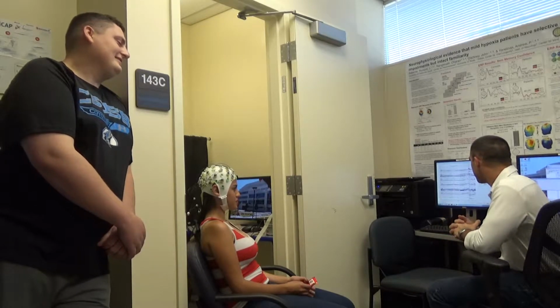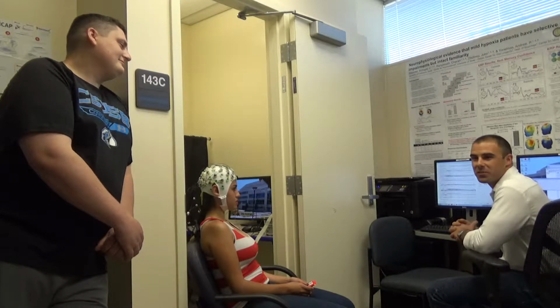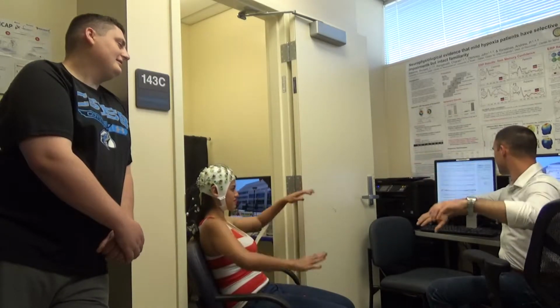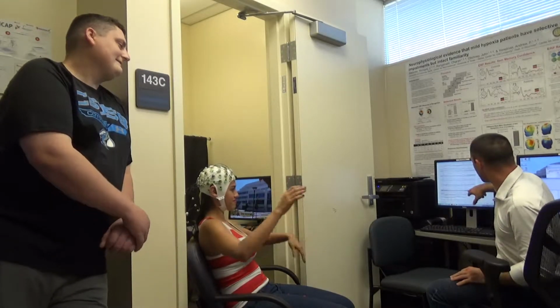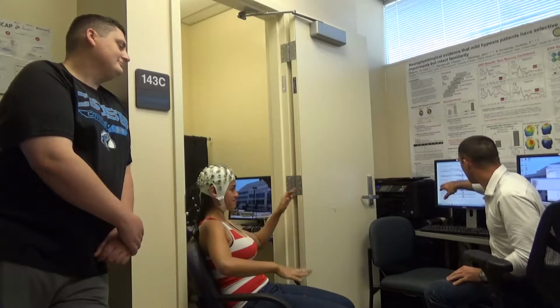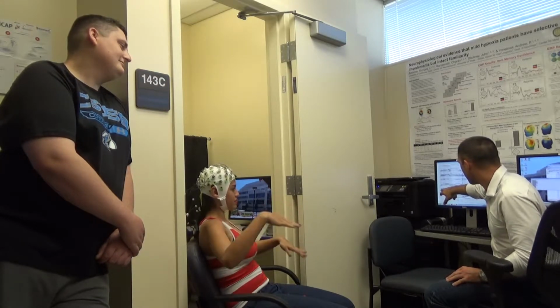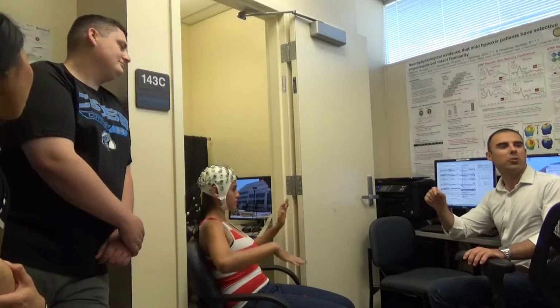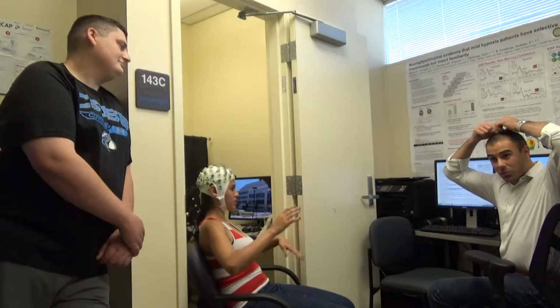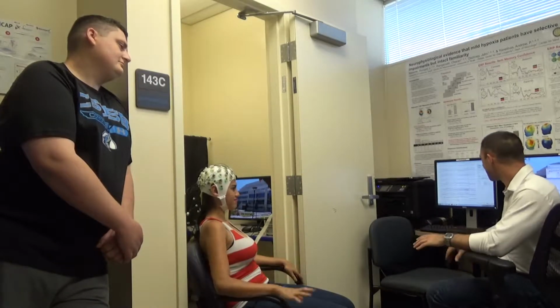So let's say that we want our participant to be really still, but she's moving her arms around. So move your arms around a little bit, right? So you start to see some motor activity, C4, FC5, some of these locations, central electrode 4. Those are really going off. Central electrode Z. Why would those show a lot of high frequency motor activity while she's moving her arms? Central, right? That's right about your motor cortex. Okay, you can chill that out.